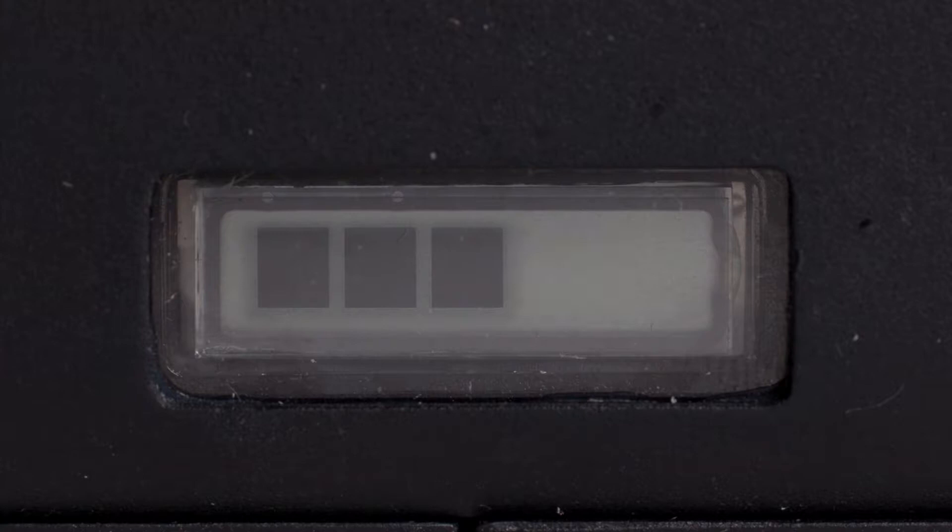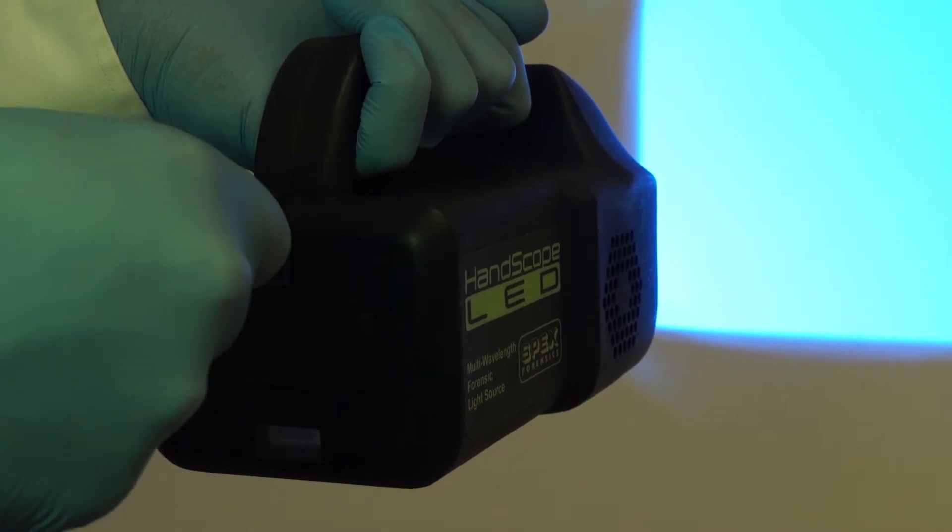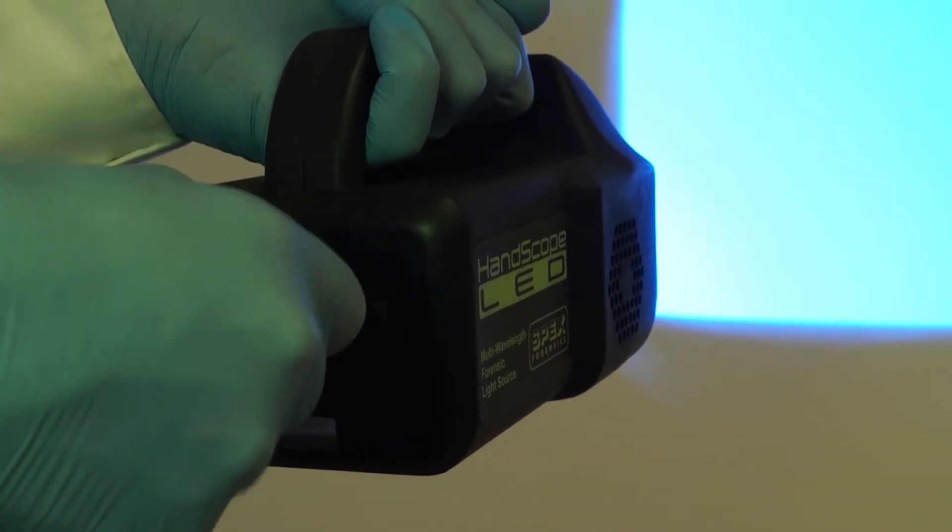Another first for the HandScope LED is the ability to recharge the battery and still run the unit at the same time. If the power indicator shows low power, simply plug in the provided power supply and recharge the battery without any interruption to the use of the unit.